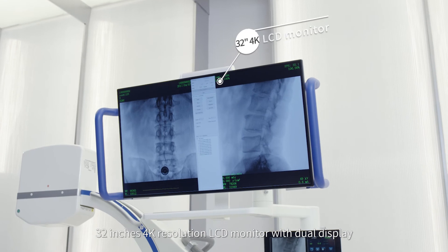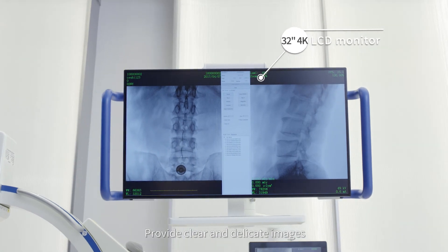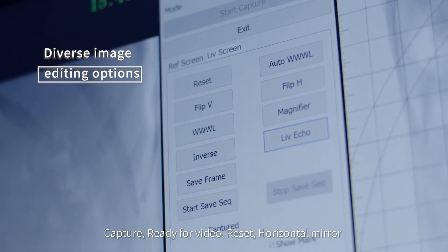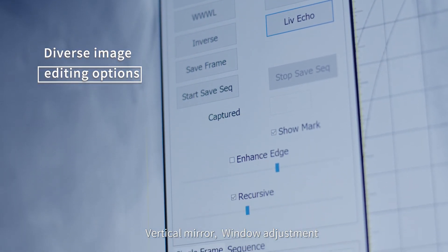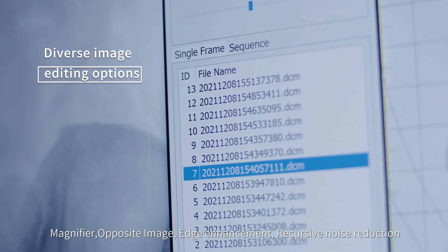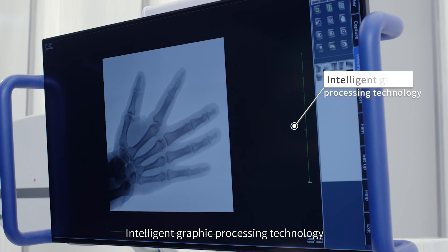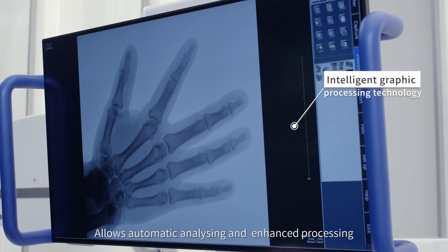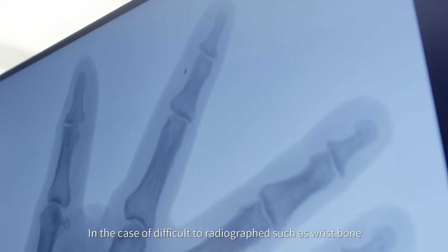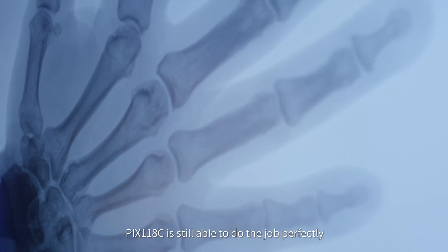A 32-inch 4K resolution LCD monitor with dual display provides clear and delicate images. Powerful image post-processing functions include: capture, video recording, reset, horizontal mirror, vertical mirror, window adjustment, magnifier, opposite image, edge enhancement, and recursive noise reduction. An exposure indicator light sits on top of the monitor. Intelligent graphic processing technology allows automatic analyzing and enhanced processing, enabling fast imaging by decreasing complicated operation. Even for difficult radiographs such as wrist bone, the PLX118C is still able to do the job perfectly.